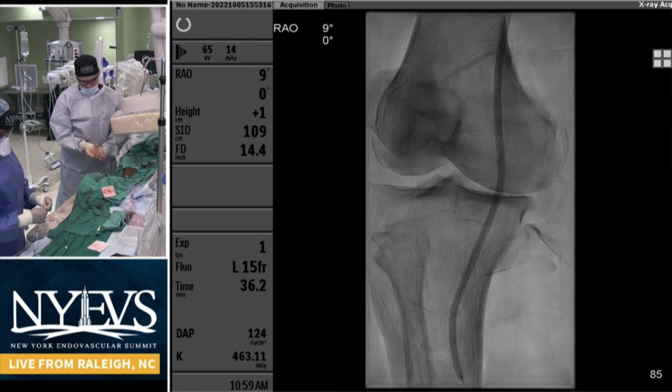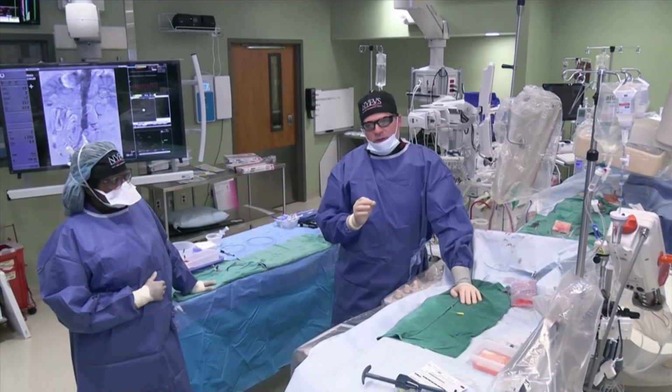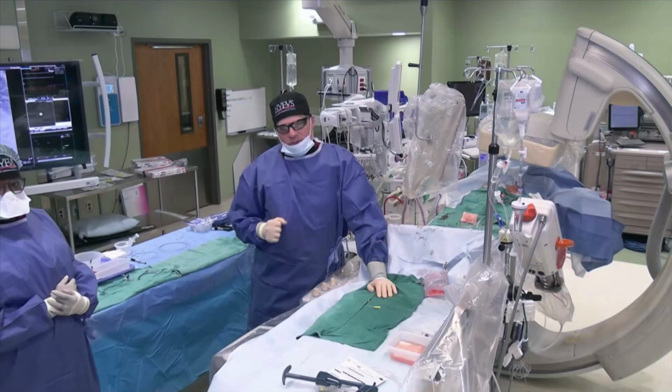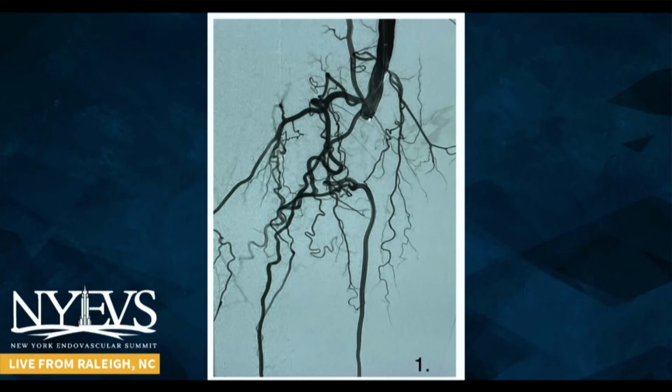Excellent case. Great job. But listen, if we could go to the slides, the case we did this morning, and let me start by saying this, that the cases that you're seeing today from me are ad hoc. So to be honest with you, until we got in there, we didn't really exactly know what we were getting until we took those initial pictures. So show them this first case.